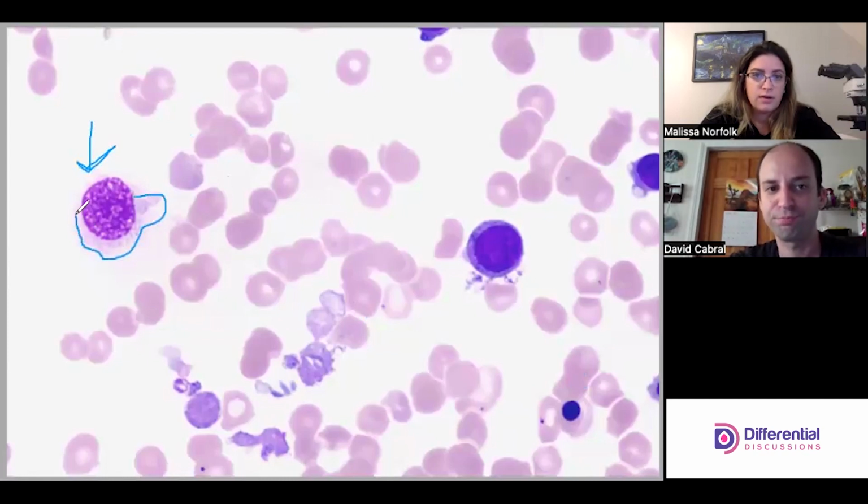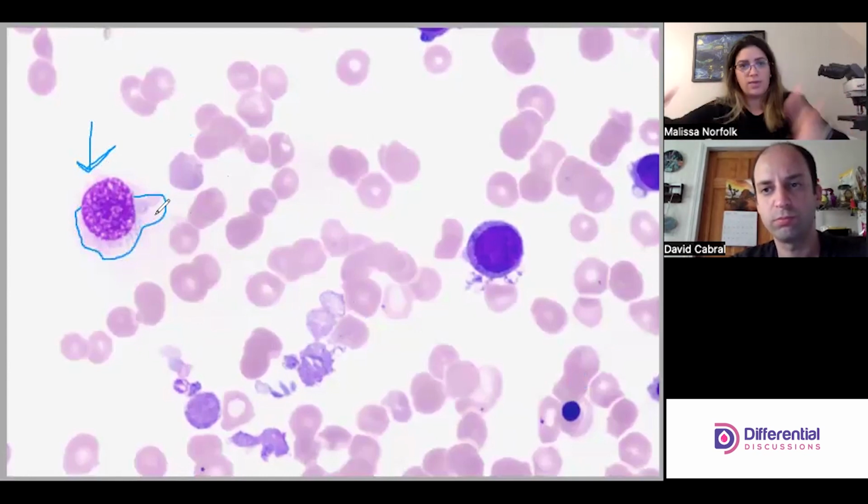It's very wispy and hard to see. There might be some up there, but you can clearly see this down here. If you look, this cytoplasm that you do see that's here and wispy kind of looks like these platelets over here. The same sort of coloration, the same sort of texture. And that's because, remember, platelets come from megakaryocytes.